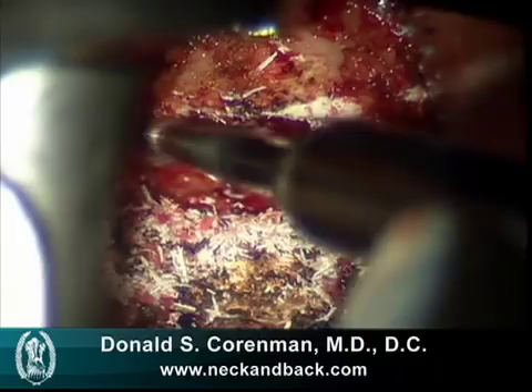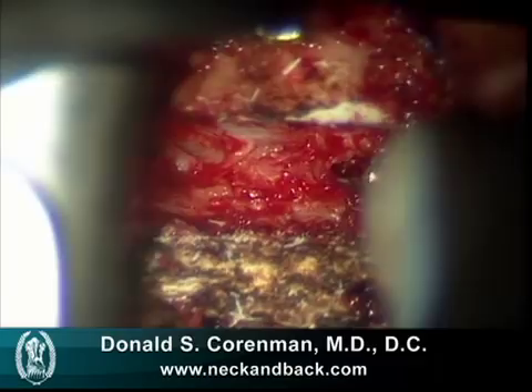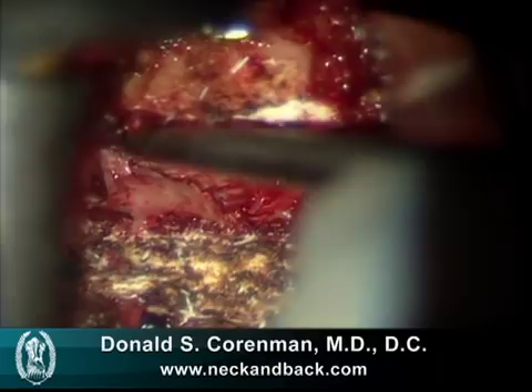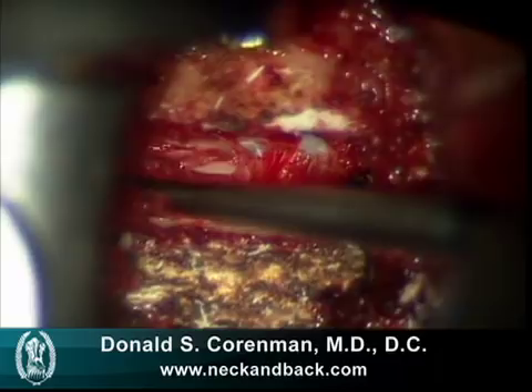We then curette the cartilage that sits on each end plate, and here we see the curette taking off this cartilage. This cartilage itself prevents bony fusion and must be thoroughly removed to prepare the end plates to accept the bone graft. In addition, the cartilage hides the bone spurs that project into the back of the canal, and we want to have those removed. Here we see removal of that cartilage using a pituitary.